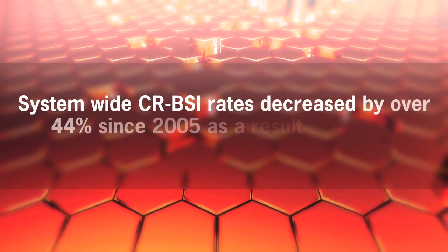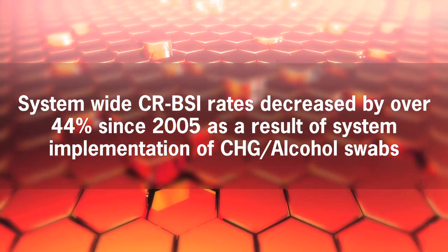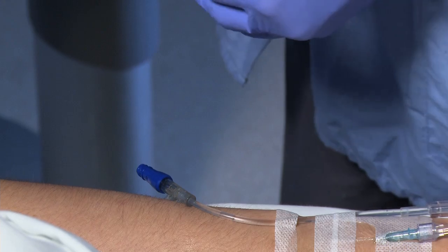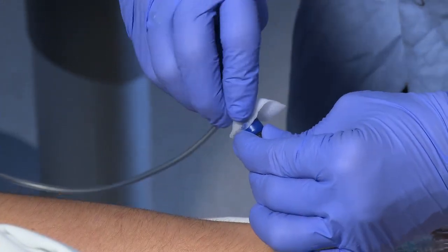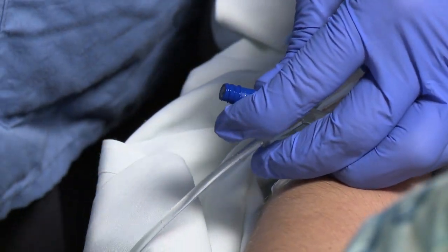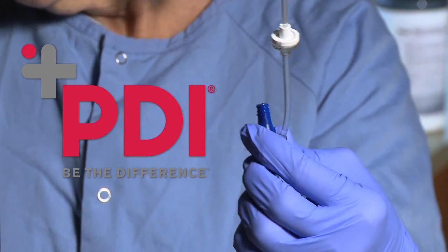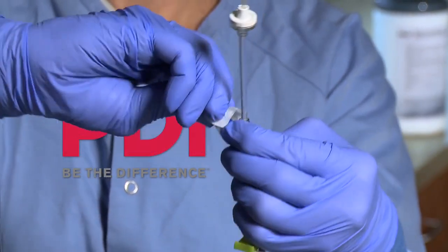The product has supporting clinical data consisting of both in vitro and in vivo testing specifically tested for disinfection of needleless access sites prior to use. Independent clinical studies have demonstrated the significant efficacy and safety of the use of chlorhexidine gluconate and isopropyl alcohol solutions for disinfection of needleless access sites. In addition to the FDA-required efficacy testing against clinically relevant microorganisms, PDI conducted extensive biocompatibility studies in support of this device market authorization.